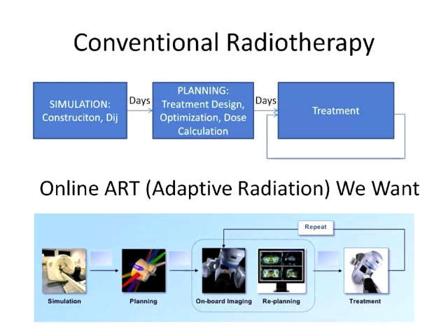In the conventional one currently used, first the patient comes with a tumor, and the radiation department takes CT scans and sees where the tumor is and how it is going to be, with a numerical simulation.